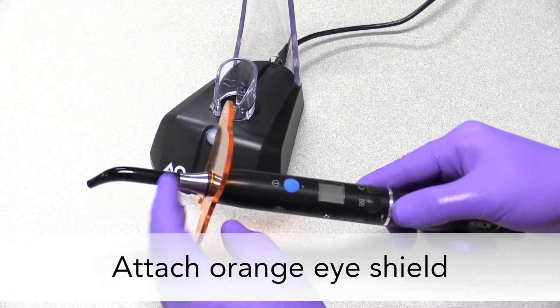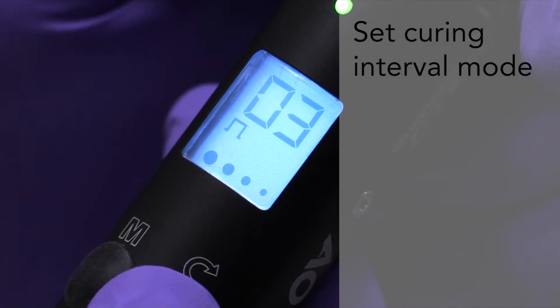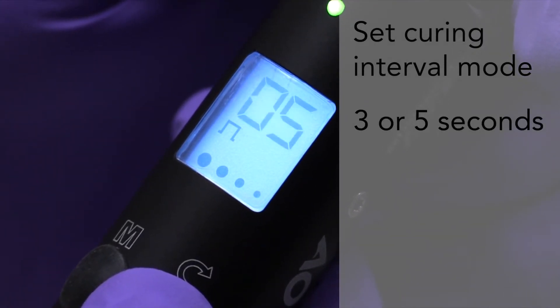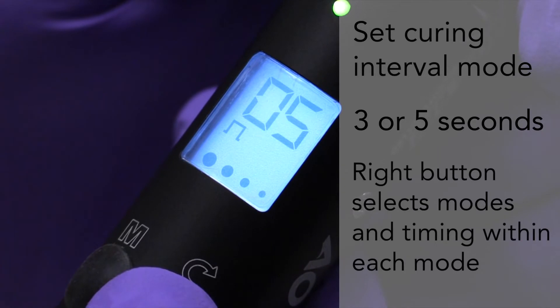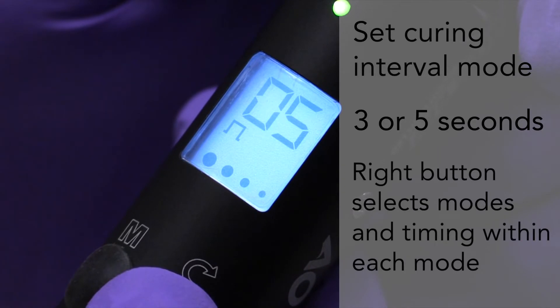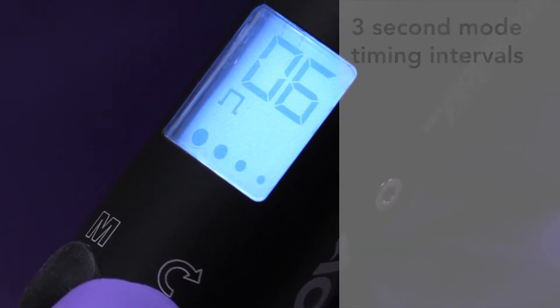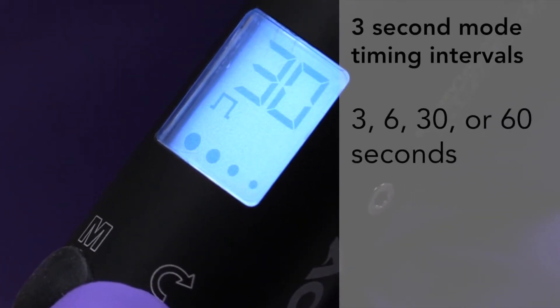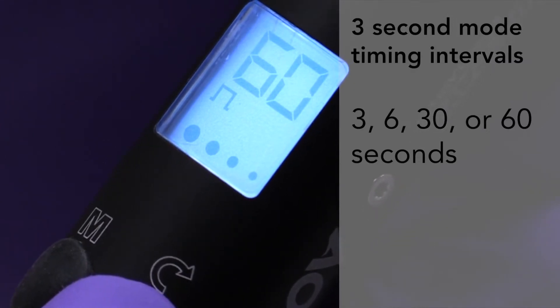Blu-ray 3 is now ready to use. Now it's time to set your curing interval mode. You can set it for either 3 or 5 seconds. Press and hold the right button to toggle between the two modes. Press and release the right button to cycle through the available timing in each mode. In 3-second mode, available timing intervals are 3, 6, 30, and 60 seconds.